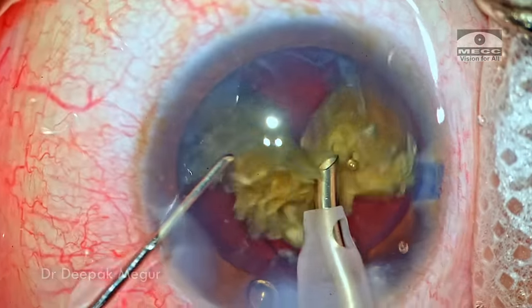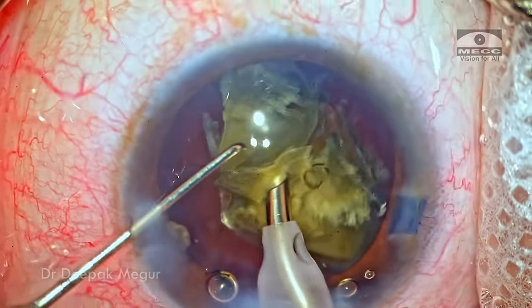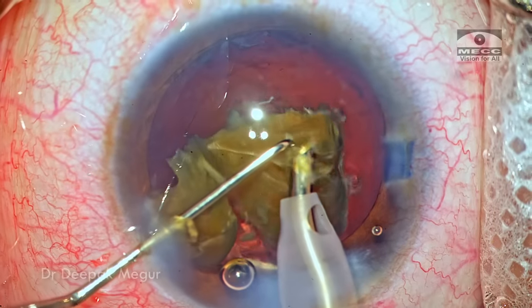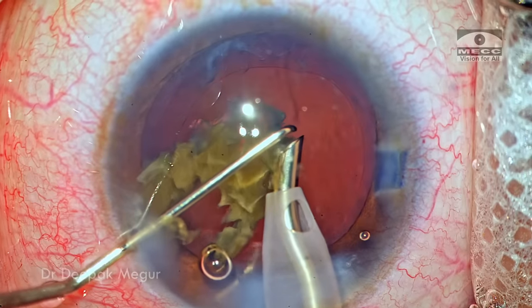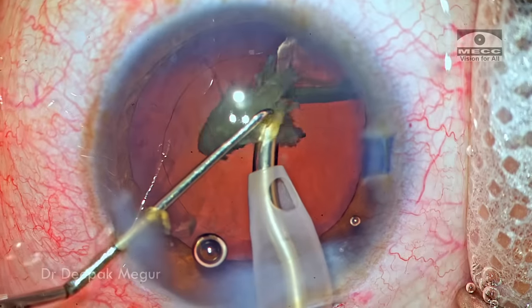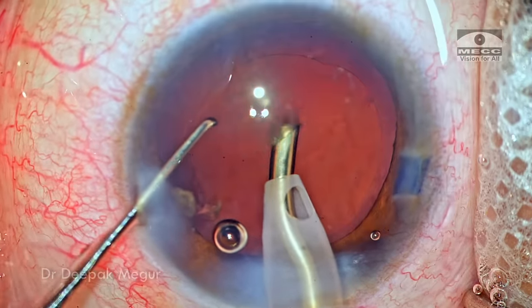If you are able to control the amount of energy delivered in a controlled manner using the foot pedal, we can minimize the turbulence and chatter which can occur in these cases. If the plane of emulsification is right and you can control lens chatter and turbulence, the endothelial damage will be very minimal, and we'll have clear corneas on the first post-op day.